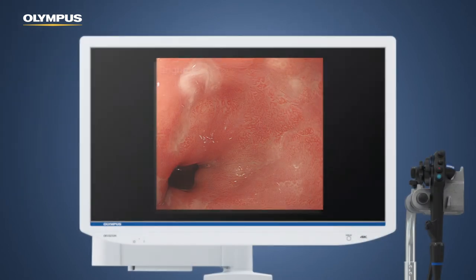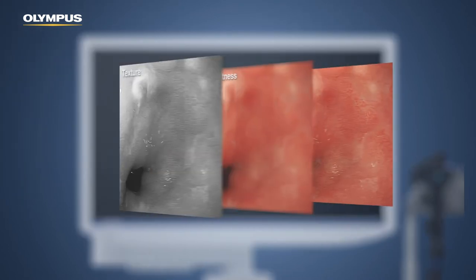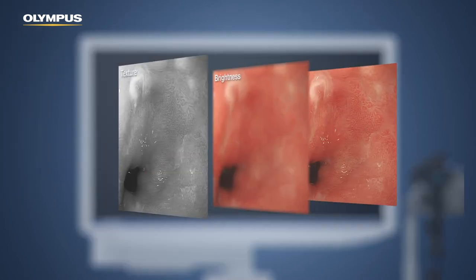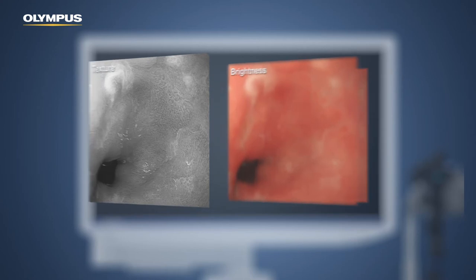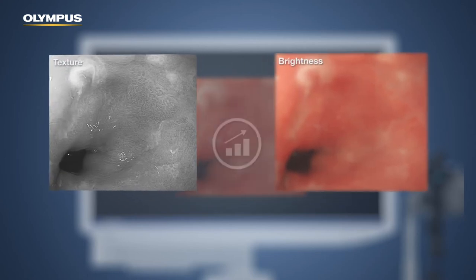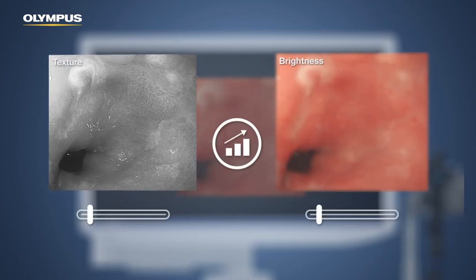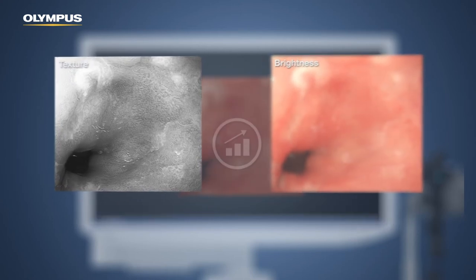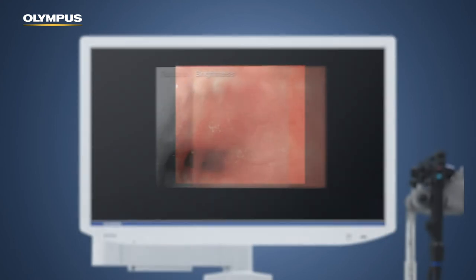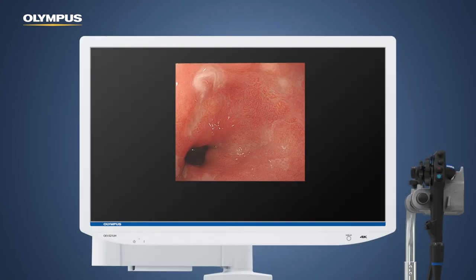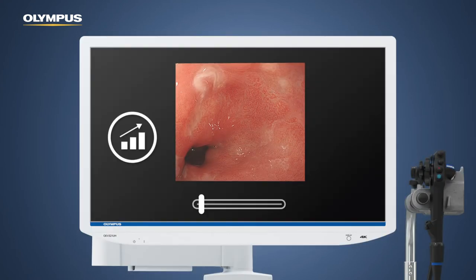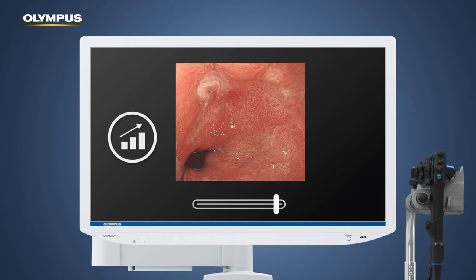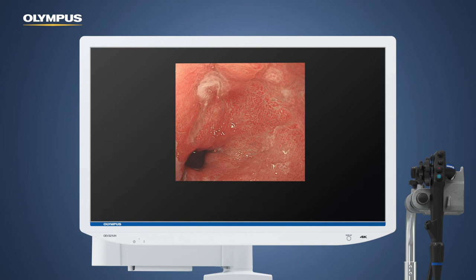The incoming image is split. Texture and brightness are enhanced. During the stacking process, both images are merged. Colour tone enhancements are made to more clearly define subtle tissue differences.